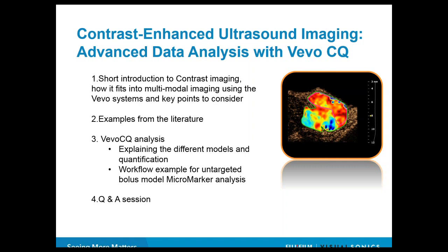So maybe the short introduction is slightly longer than I was aiming for in the beginning, but nevertheless, from there we'll move on to some examples from the literature, and then we'll dive right into the VevoCQ analysis, looking at the different models, quantification, and I'll also show you a brief glimpse of the software itself and show you how to navigate around. And then in the end, as Stephen just said, we'll have a short or slightly longer question and answer session. So let's get started.